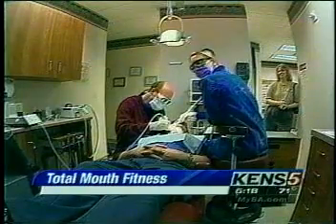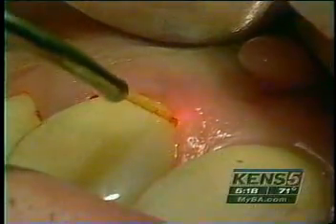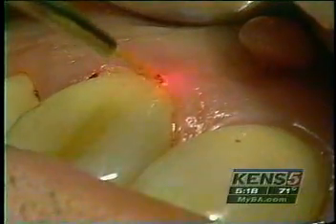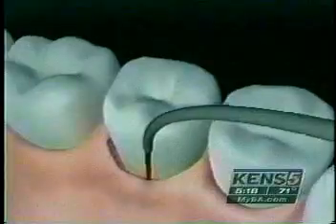The newest weapon in Dr. Paul Wilkie's gum disease arsenal is called periolase. It uses a controlled light to blast away the bacteria that's causing the chronic infection. The first pass with the laser actually separates the gum from the root and vaporizes the diseased tissue, leaving healthy tissue intact.